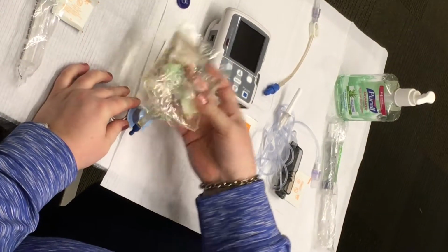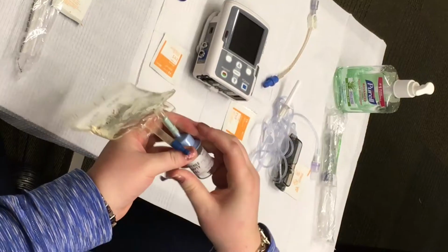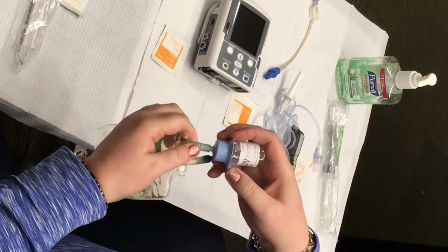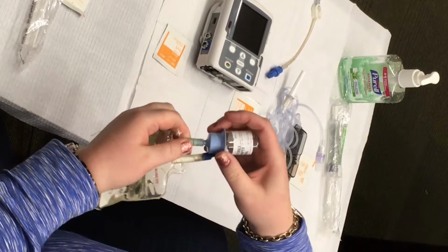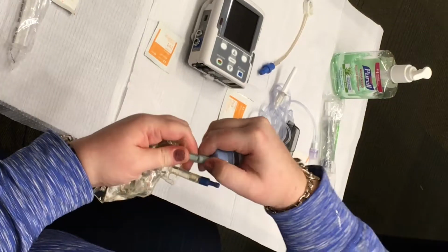Grasp the adapter firmly with one hand, pull gently on the medication vial with the other to confirm that the medication vial is securely connected to it. Using both hands on the stem between the adapter and the mini bag, bend them up and down repeatedly to break the seal.